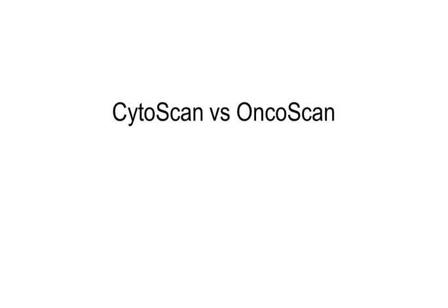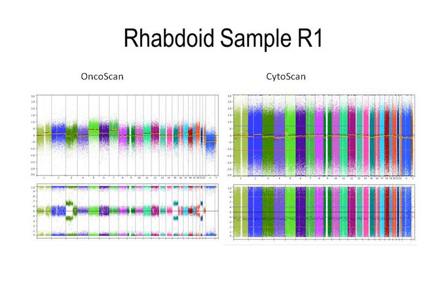So I want to go on and show you some of the screenshots of the two different approaches we use, only a couple of cases to show how OncoScan was much more clearer and very useful in data analysis as compared to Cytoscan, which is a fantastic product on its own, but we use it mostly for inherited disorders in pediatric and prenatal situations.